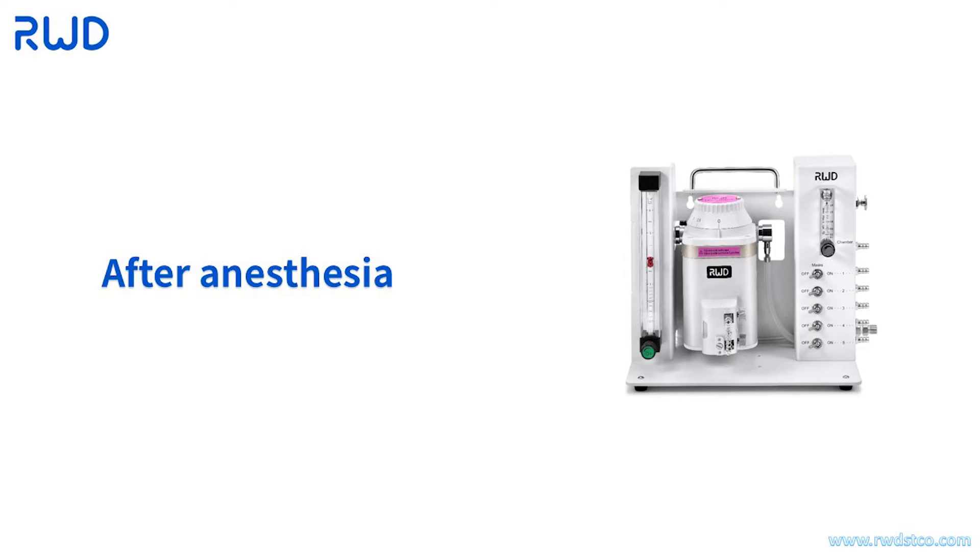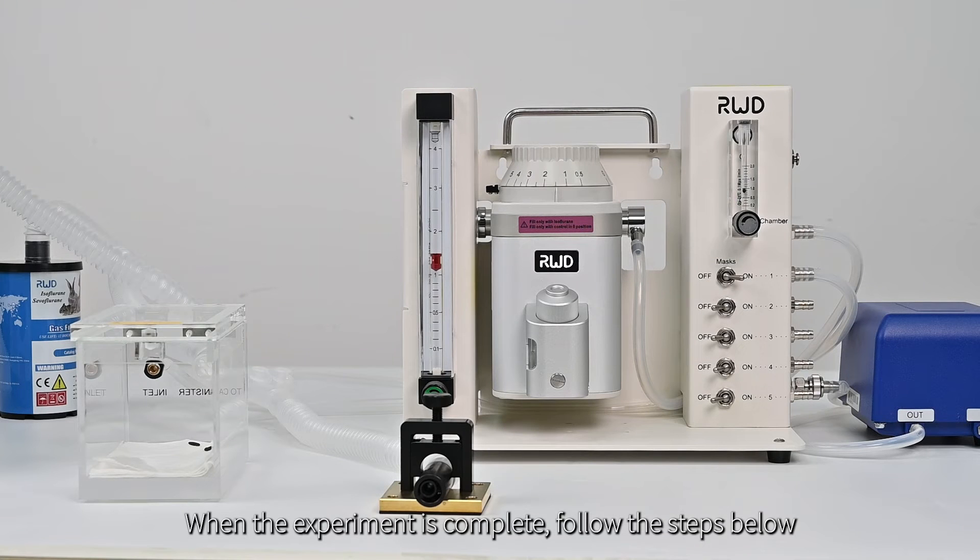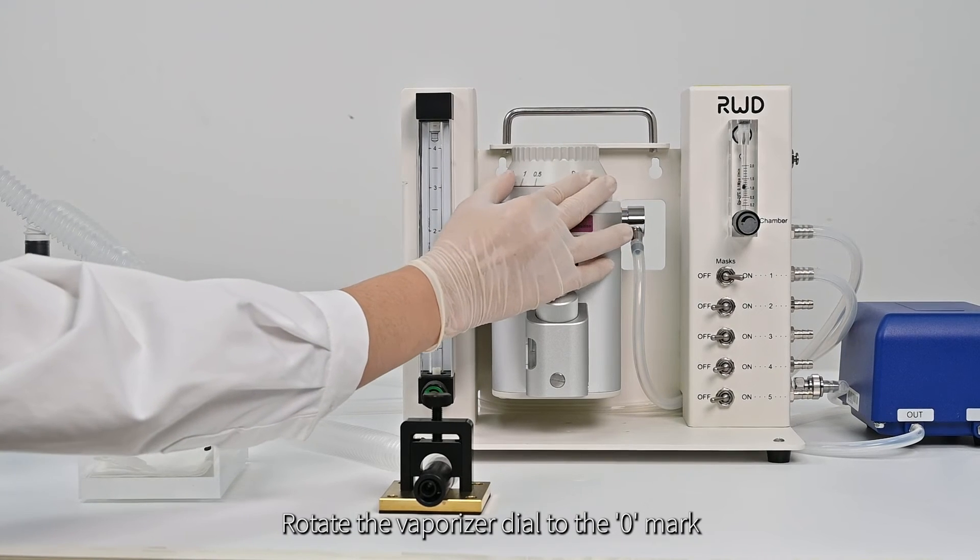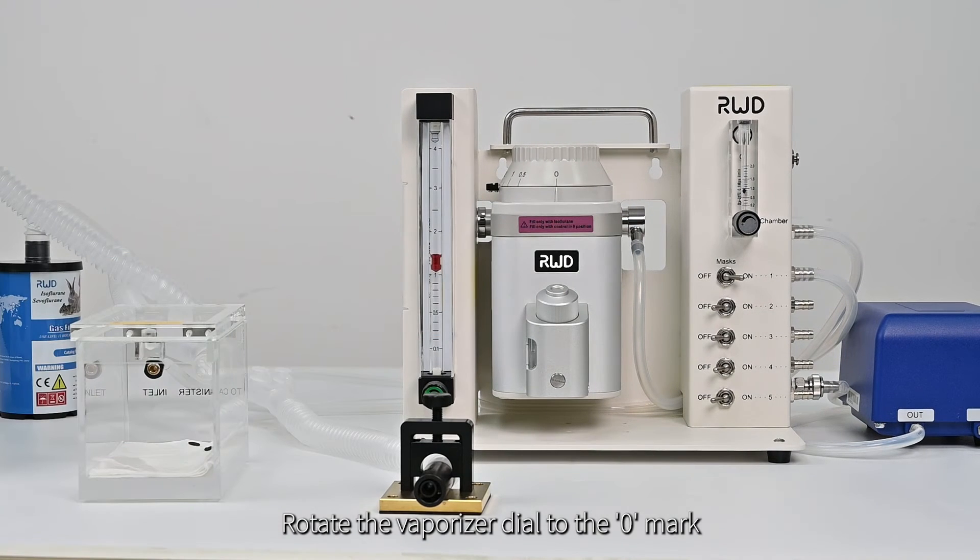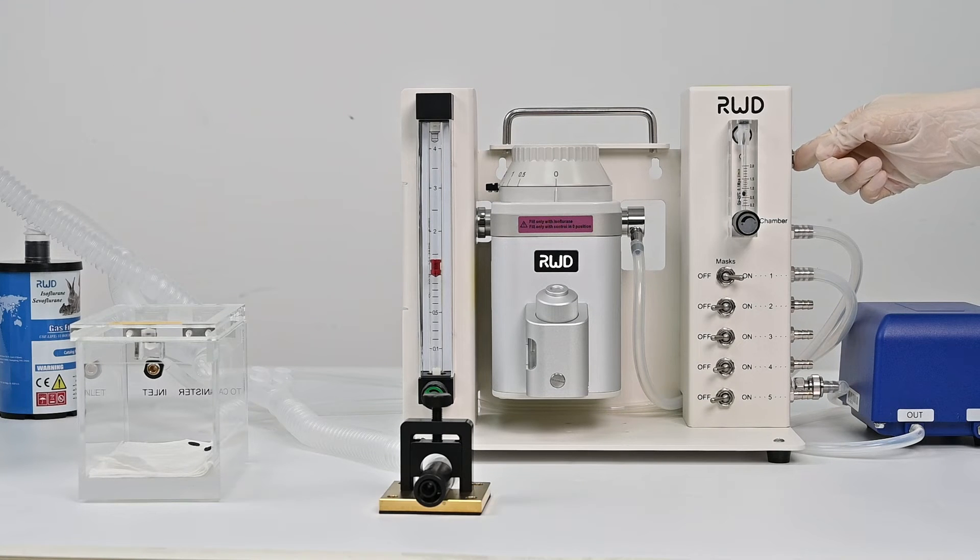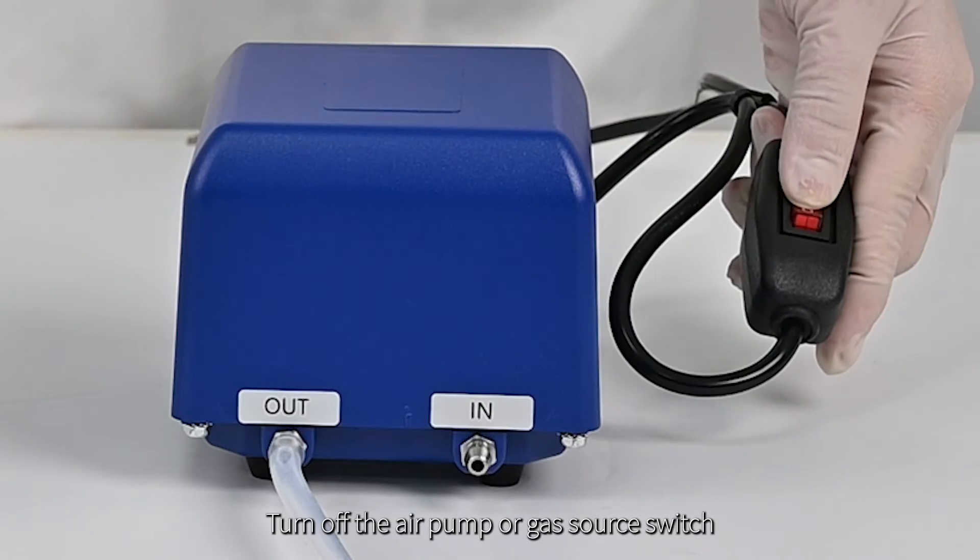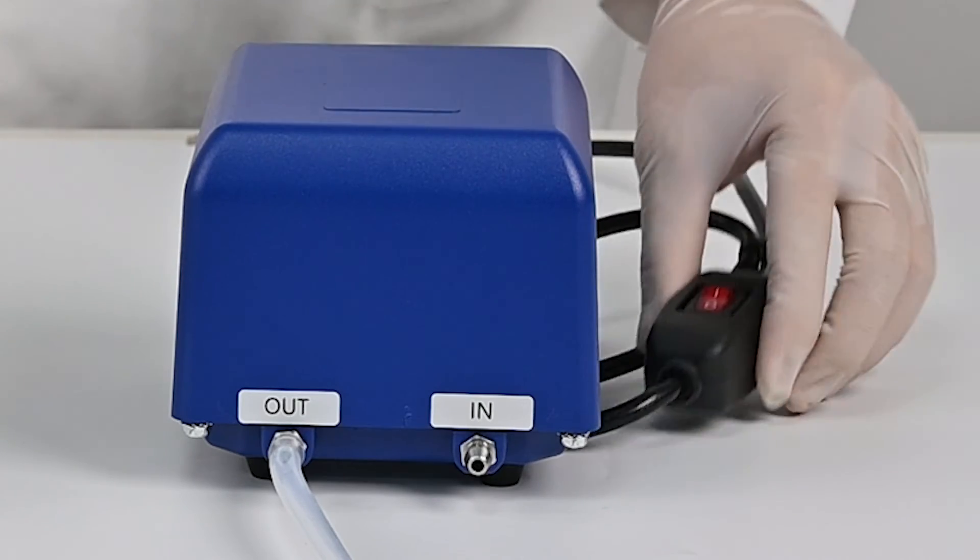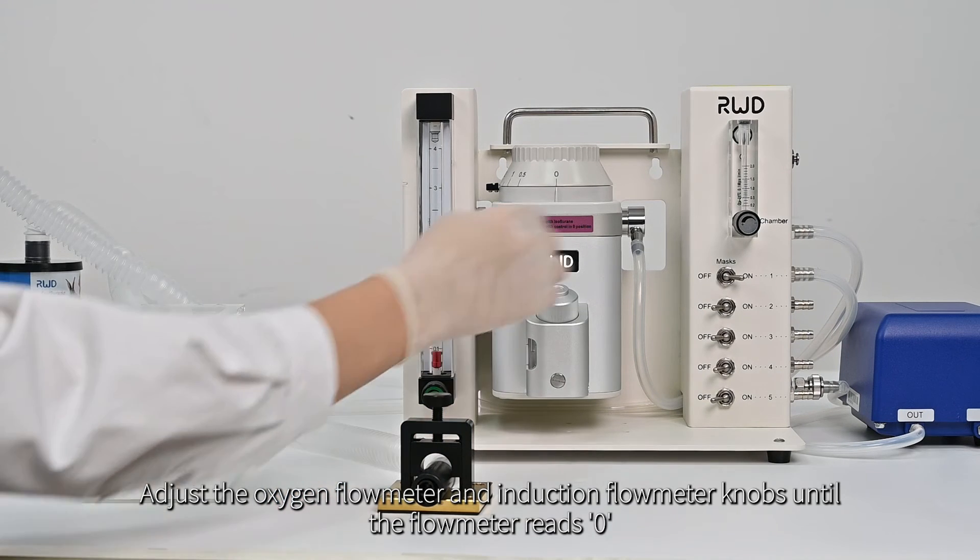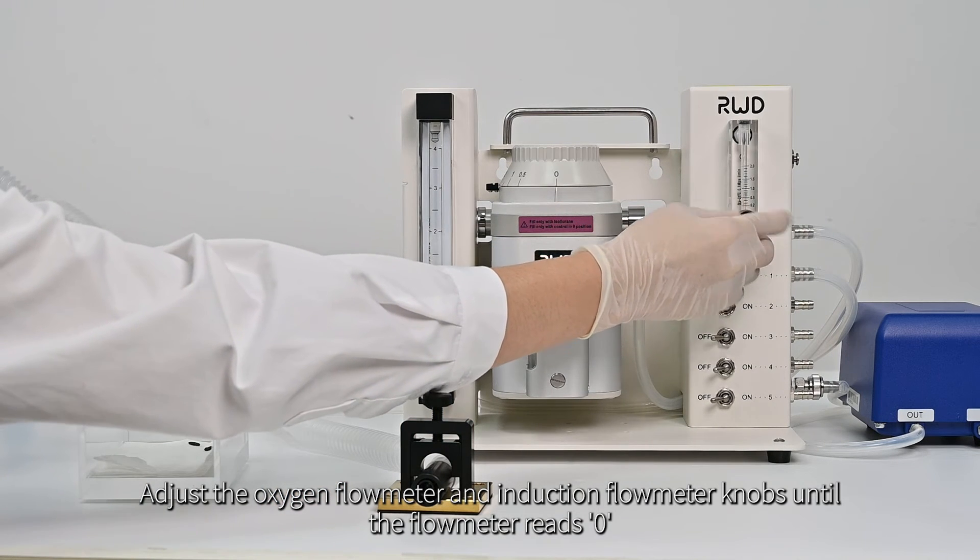After anesthesia, when the experiment is complete, follow the steps below. Rotate the vaporizer dial to the zero mark. Press the O2 flush button to dilute the anesthetic gas in the induction chamber. Turn off the air pump or gas source switch. Adjust the oxygen flow meter and induction flow meter knobs until the flow meter reads zero.